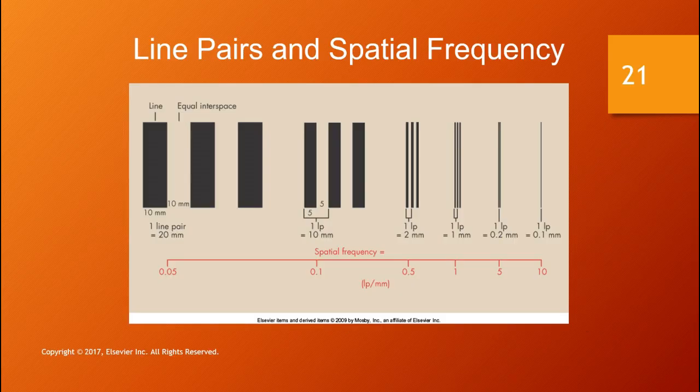Okay, and then we're going to wrap this up by briefly discussing some attributes on how you can tell if you have good recorded detail or spatial resolution.